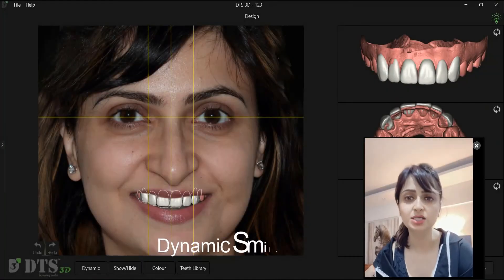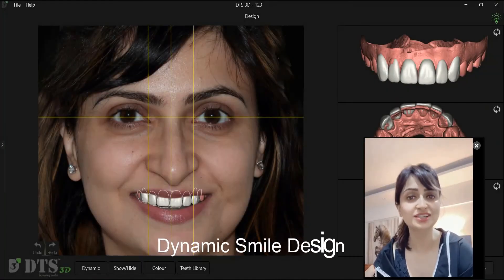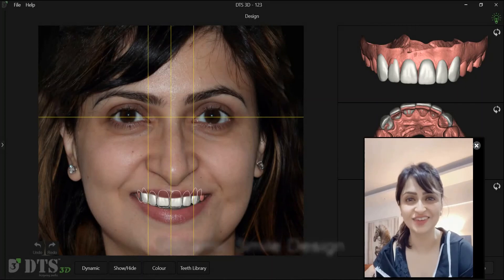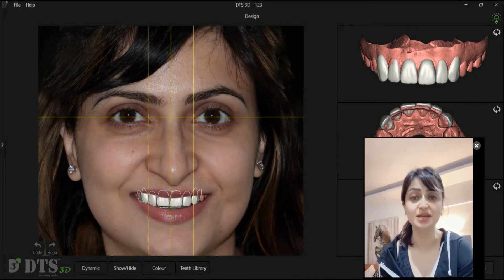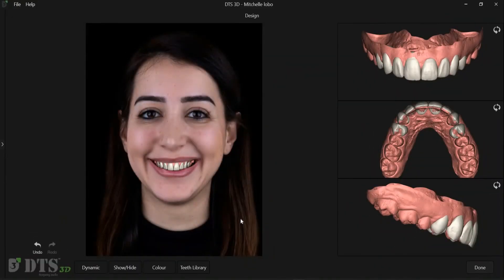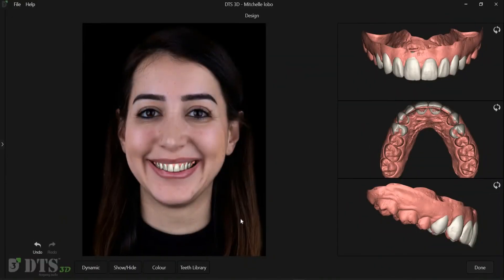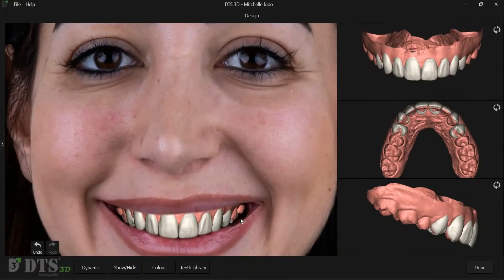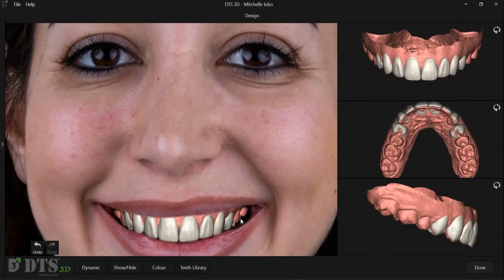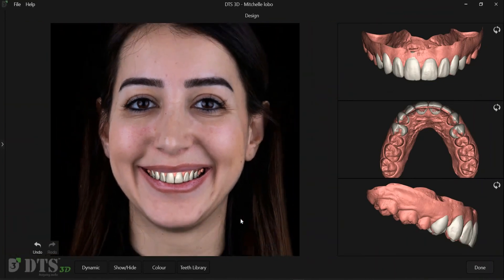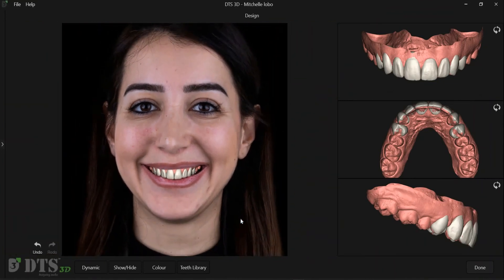Patient videos can be used as reference during the smile design process. This facially-driven aesthetic planning helps patients visualize their new smile and makes them a part of the treatment planning process.